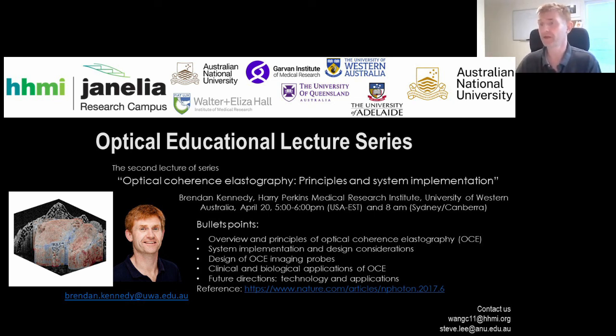The 20 patients we've scanned has brought up a number of issues that need to be resolved. So for example, we need to apply more deformation, and we need to account for the angle of the probe. So we're working through the technical improvements of the probe. And then ultimately it's going to be, what does in vivo breast tissue look like mechanically? I don't think anybody knows that.